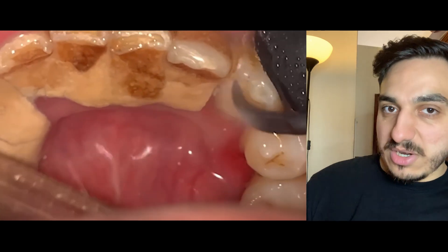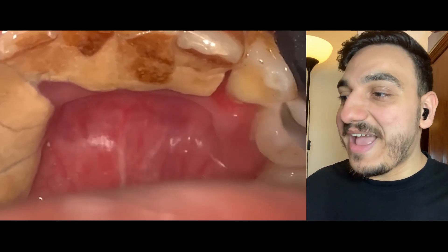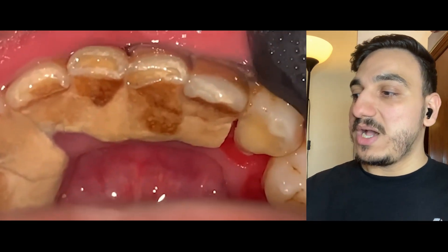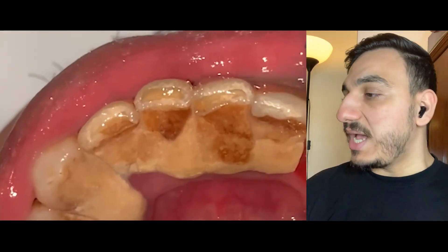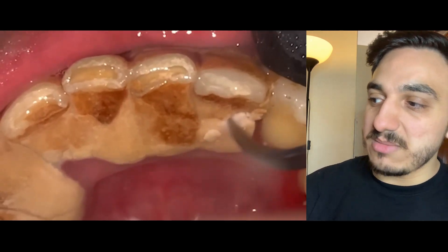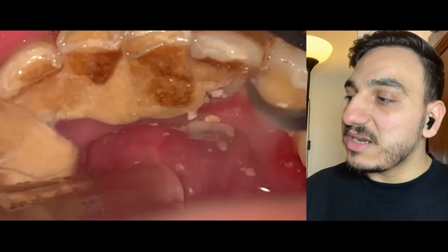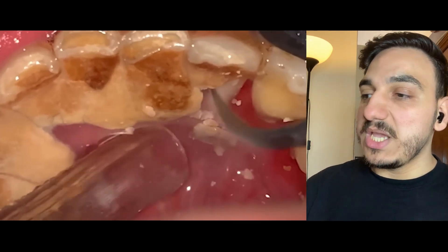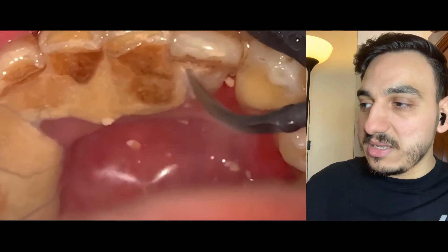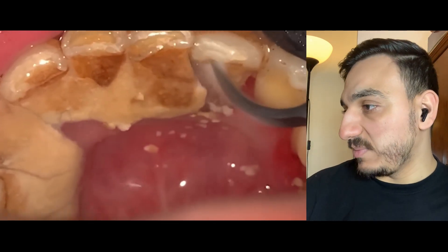The teeth appear to be clean to a certain degree underneath all these walls of dental tartar and dental calculus. Unfortunately, on some teeth we have really extensive accumulation, and as you can see the gums are really inflamed underneath. The technique the operator appears to be using is breaking that huge dental calculus and dental tartar into slightly smaller pieces.